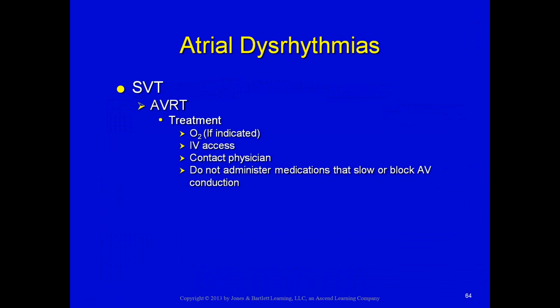So typically we're not able to diagnose this AVRT from any other supraventricular tachycardia unless we know what we're looking for. So what most people will do, and what certainly is allowable, is that if you've got somebody with a normal width QRS tachycardia that is greater than 160, that could be atrial tach, atrial fib, atrial flutter, AV nodal tachycardia, or AV reentrant tachycardia.